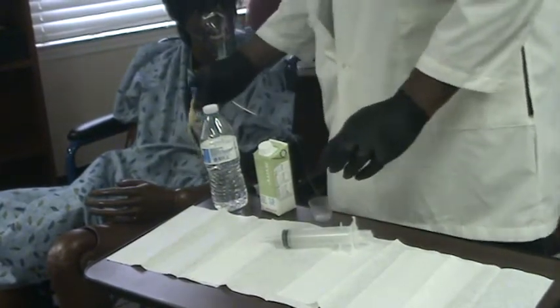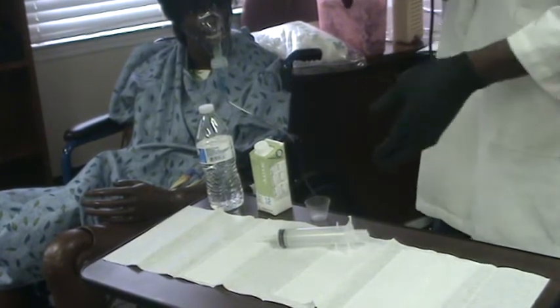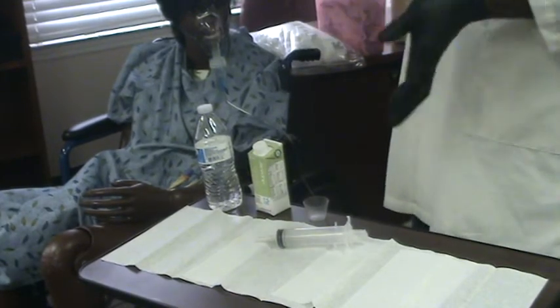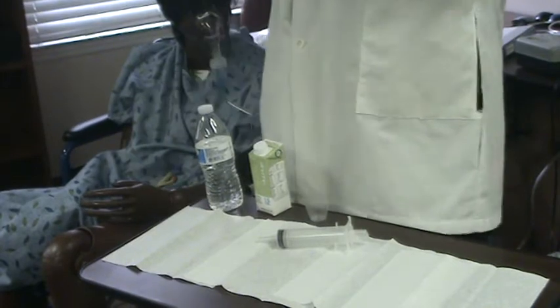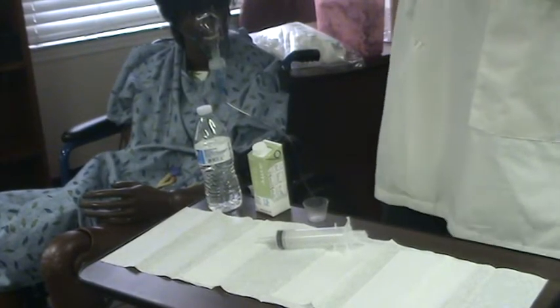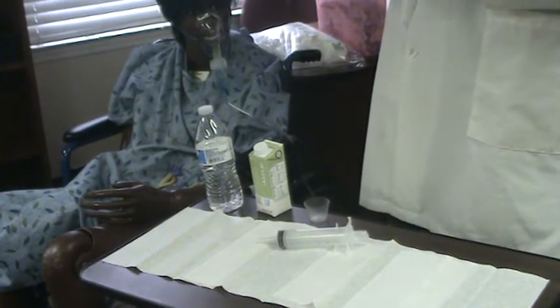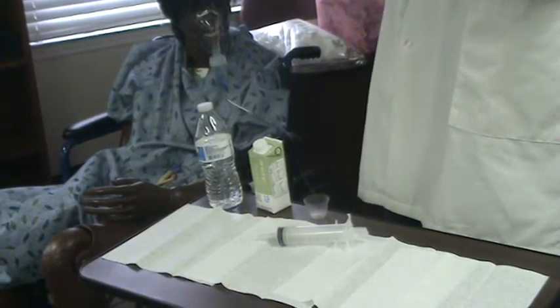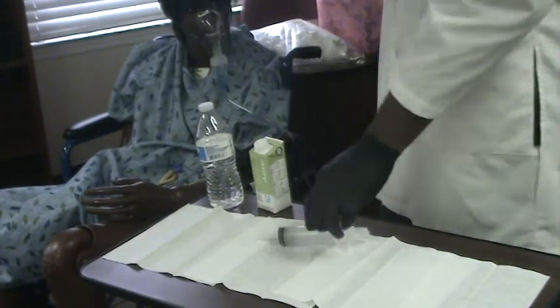When you're doing the feeding, whether feeding or medication, you must always flush the tube first. Do the feeding or the medicine, then flush again. This should always stay open. Otherwise, if you don't flush it, the milk gets thickened in the tube and blocks it. If it's blocked, it's very hard to unblock. Sometimes they have to go to the hospital to unblock it. Or the particles of medicine you gave can clog it, so you always have to flush it.